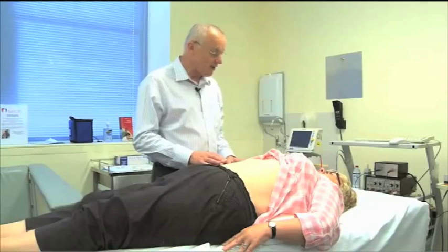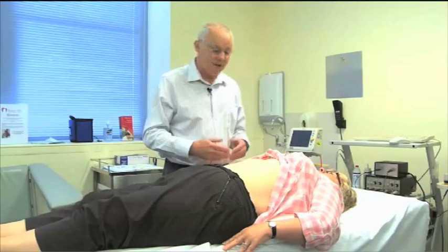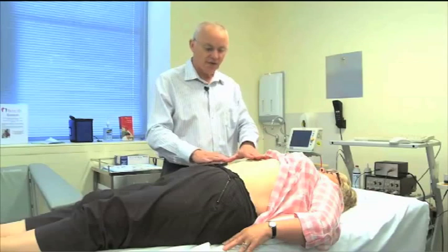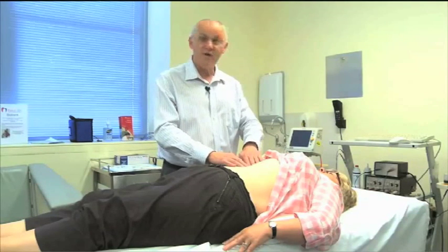Okay, so if you pop up here. Okay, Lynn, now we've got you. I hope you're comfortable there. Yes, I am. Notice that we've got the pillow under the small of the back, and this raises and stretches the surface of the abdomen a little bit so that we can feel the port easily.